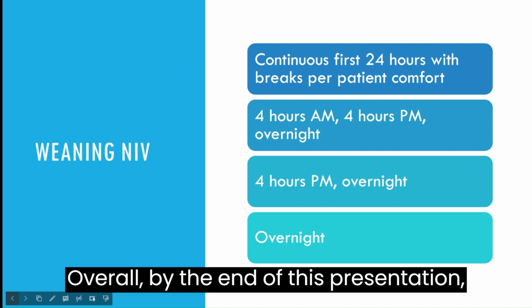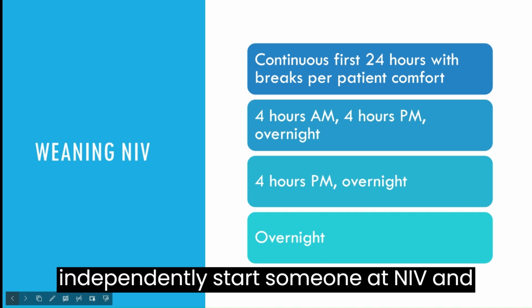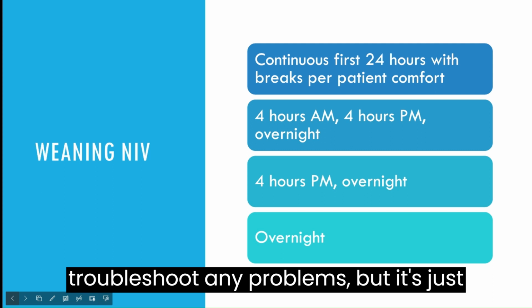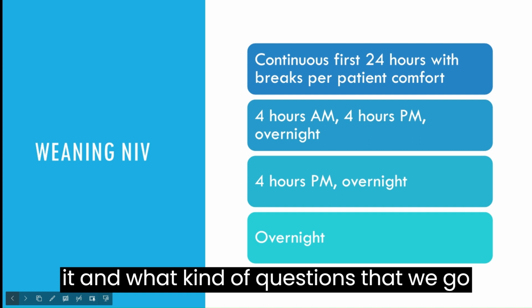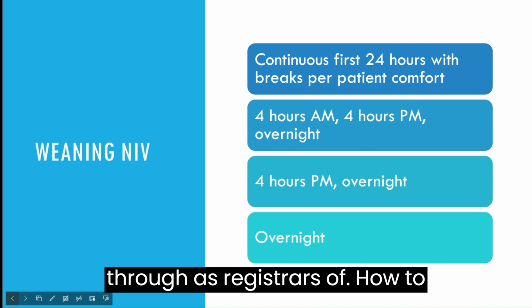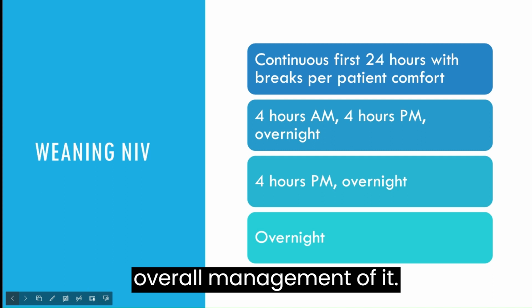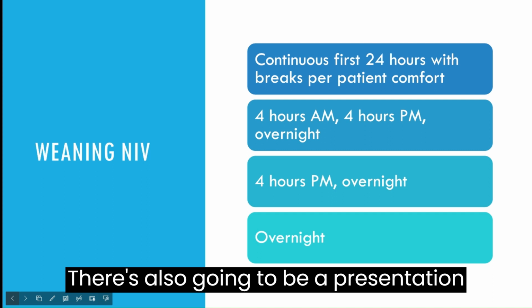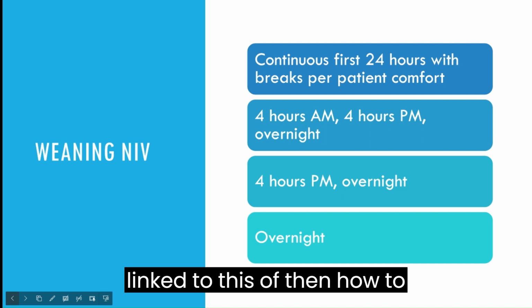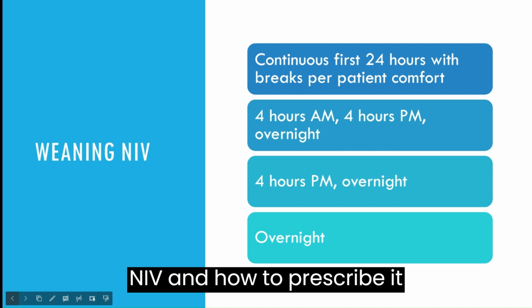Overall, by the end of this presentation, we're not expecting you to be able to independently start someone on NIV and troubleshoot any problems, but it's just to give you an idea of when to consider it and what kind of questions we go through as registrars on how to manage NIV, and give you an idea of the overall management of it. There's also going to be a presentation linked to this on how to appropriately document NIV and how to prescribe it appropriately.